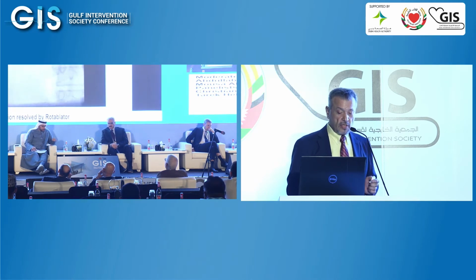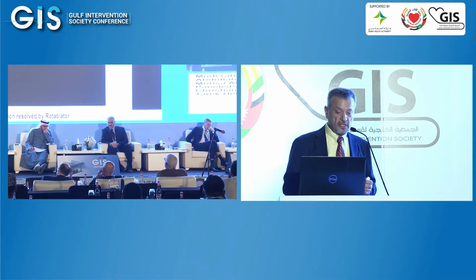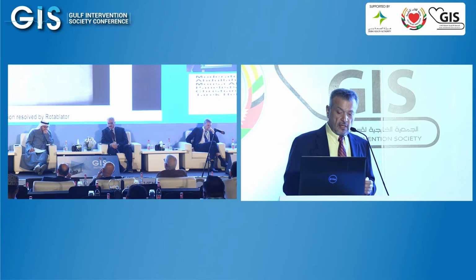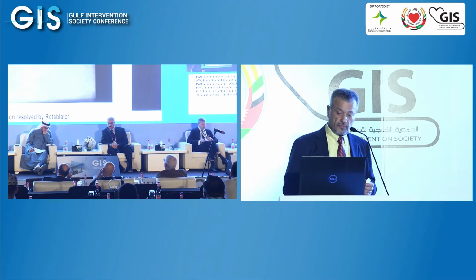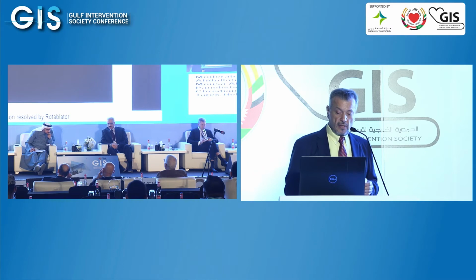Finally, I decided to tackle my RCA because here I still have to solve an additional large area of ischemia. And I crossed with the Gaia 2, but with extreme difficulty. Then when I found myself way into it, I said, okay, but I'm not sure. I cannot see any flow distal to the vessel. I put in a microcatheter and double-checked. It turned out that I'm in the right place.